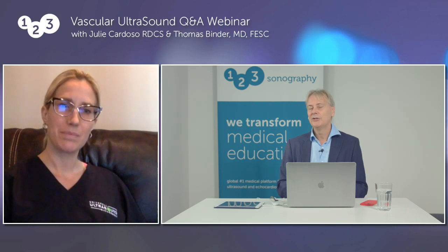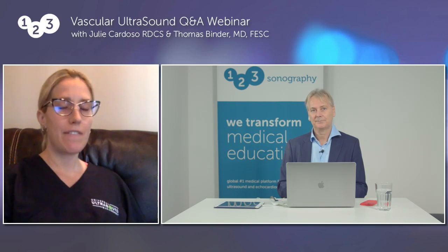And maybe Julie, you can say something about the importance of vascular ultrasound. Just the fact that ultrasound in general, and particularly for vascular, really helps with the management of the patient. These physicians are really looking to answer the clinical question quickly, and ultrasound is real-time information where we can image the vessel of interest, whether it's an artery or a vein, and figure out what's going on in order to manage that patient effectively. And again, with the facilities that I work at, these patients have advanced disease, CLI patients, critical limb ischemia. So this is their last resort before amputation.